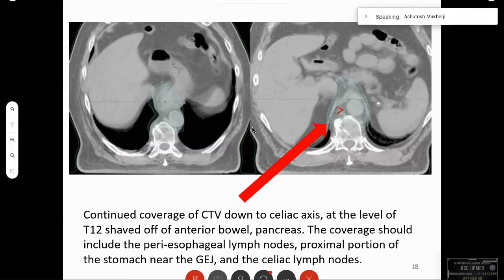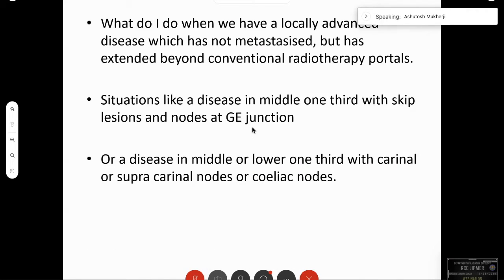The CTV continues down to the celiac axis at the level of T12, shaved off the anterior bowel and pancreas. This coverage should include the periesophageal nodes, the proximal portion of the stomach near the GE junction, and the celiac axis. These are general rules for esophageal planning.